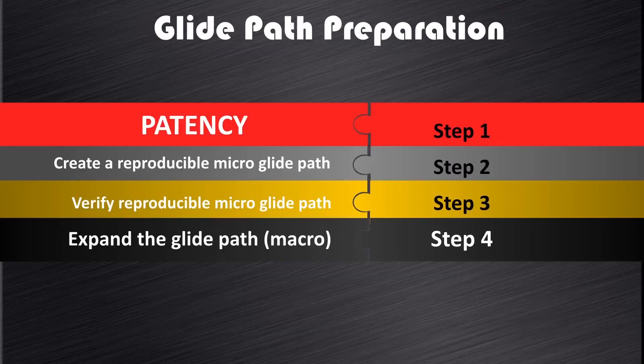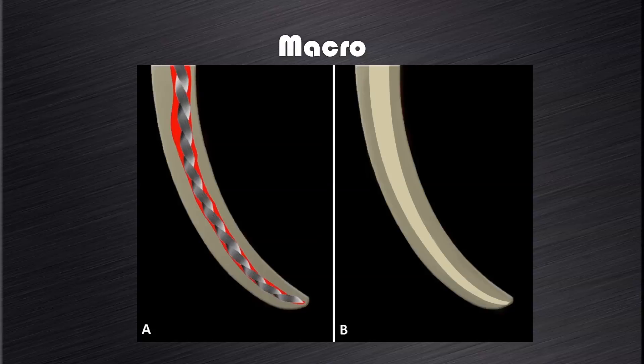Now we are getting to the last stage of glide path preparation, and that is to expand the micro glide path using rotary glide path instruments — for example, Path Files or a single Pro Glider instrument. This will create an even smoother and more regular glide path, making the root canal ready to accept any root canal preparation instrument with safety and respect for the root canal anatomy.